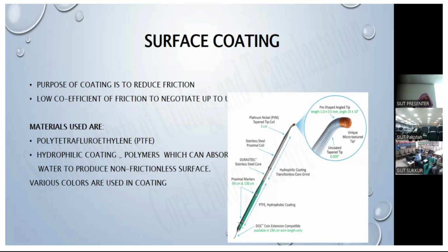So they do not denote something which is very important unless and until you go into the details of something written on the envelope. What is the length of the wire? What is the caliber of the wire, which means the cross sectional diameter of the wire, and the coating? These are the 3 main things on which you have to place your technical caliber.